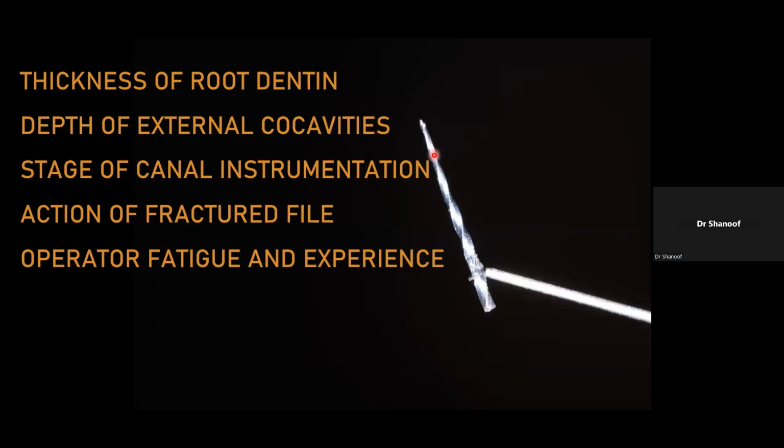If the file is broken in the initial stages of the treatment, the treatment plan will differ from a file broken in a later stage of the preparation. In the initial stages, we have not removed all the necrotic debris and all the bacteria, and the canal is not completely disinfected, so you should consider this factor also. Then consider the action of the file, because when you use ultrasonics for retrieval, you should always use them against the motion of the file.